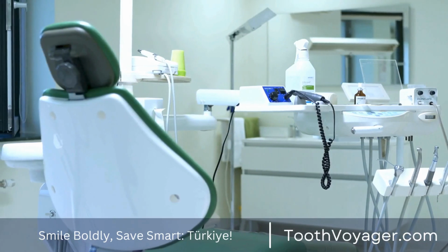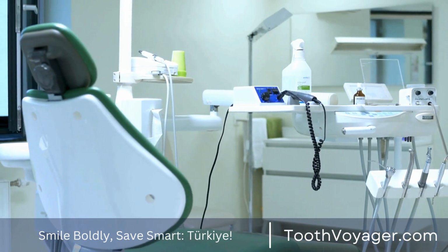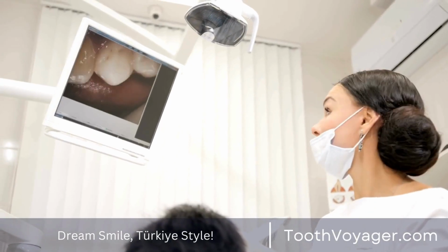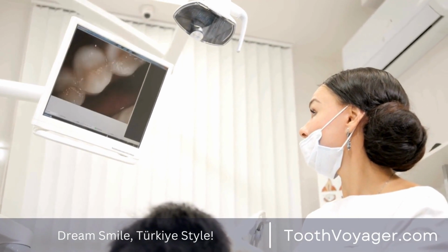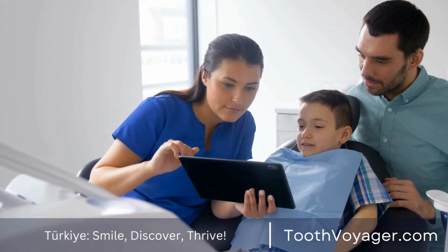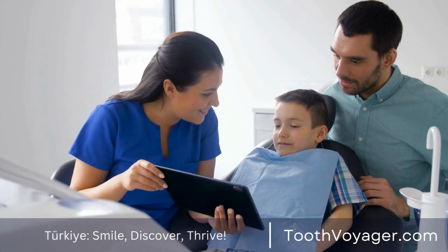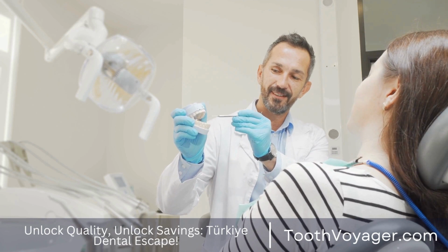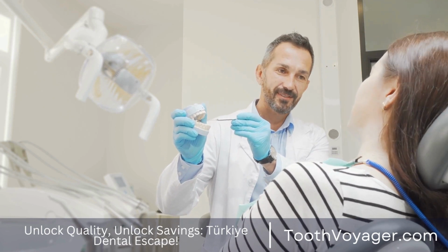Implant placement. After the patient is considered a good implant candidate, the next stage is to place the implants. The procedure involves surgical placement of the implants in the jawbone. There it eventually will join the bone, a process known as osseointegration. This is a crucial step to the longevity of the implant because it creates a solid base for the restoration.